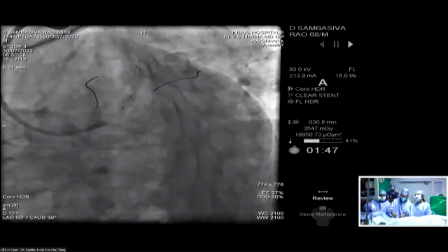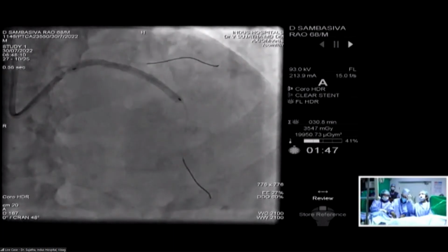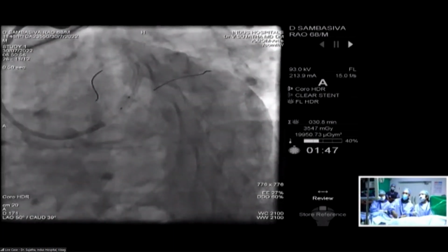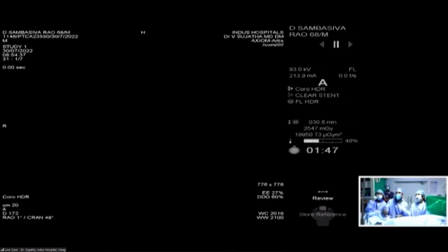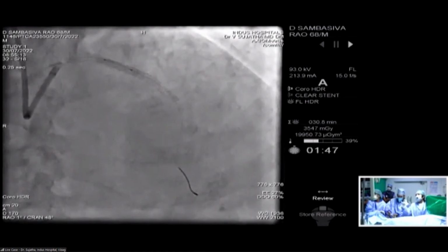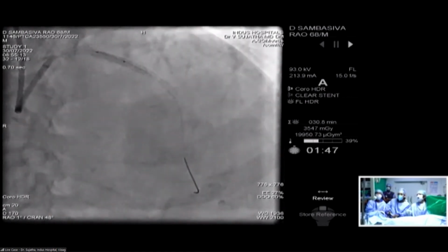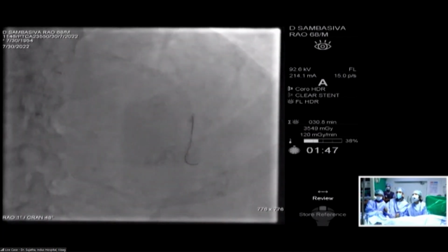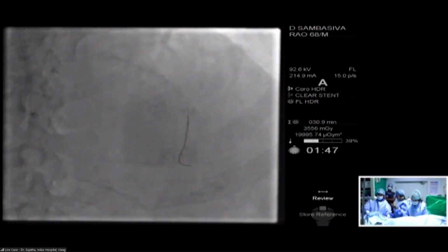So this is the stent. Show the stent expansion. This is the stent, sir. As you told, there is an under expansion there. Yes. Next, then POT. Next. Go quickly. Then we started the dot. As I told you, when I was trying to push this balloon, I had a problem. So I was forced to remove the OM wire. So we'll do the OCT and see whether there are any struts across the circumflex.